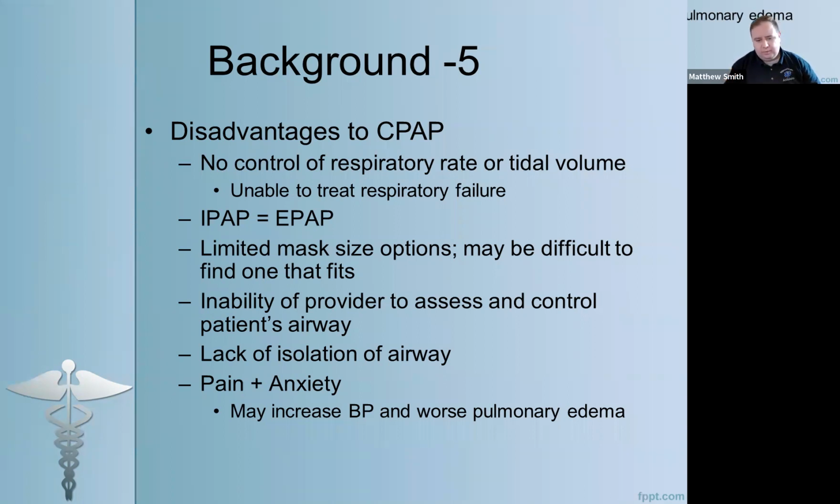Lastly, one of the big disadvantages to CPAP that you'll see in actual practice is an increase in pain and anxiety. It can be uncomfortable for these patients. Oftentimes, patients that need CPAP feel like they're suffocating, and so putting something on their face makes them feel like they're suffocating more. Now, that is a transient feeling, and if you can get them to calm down and get them to trust the machine and get them to breathe through the machine, they're going to do better. But you may well have patients that when you put this on, they try to swat it away and say you're suffocating. So just be aware of that. And if they just can't tolerate it, well, then you can't use the therapy.